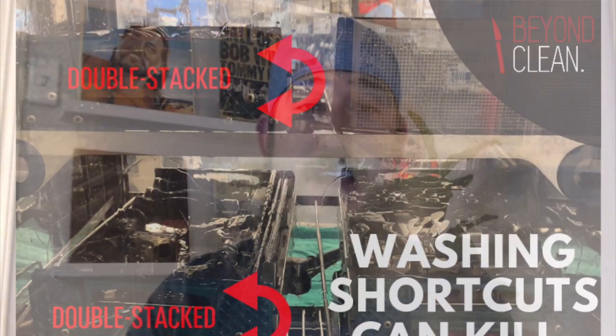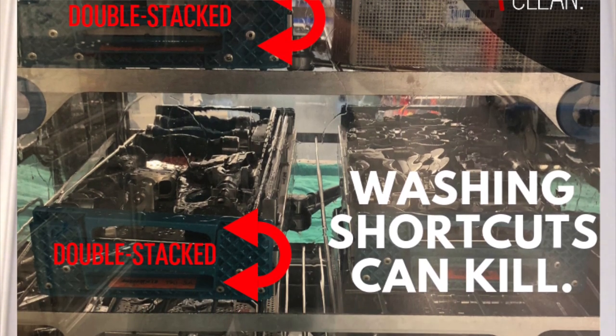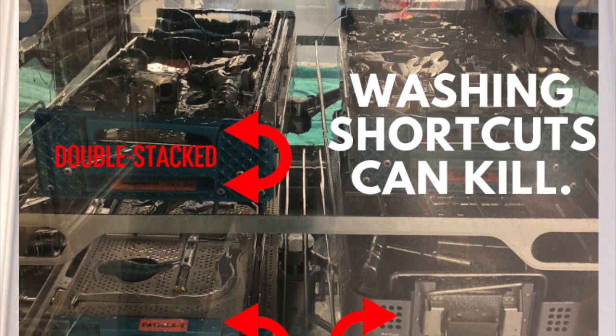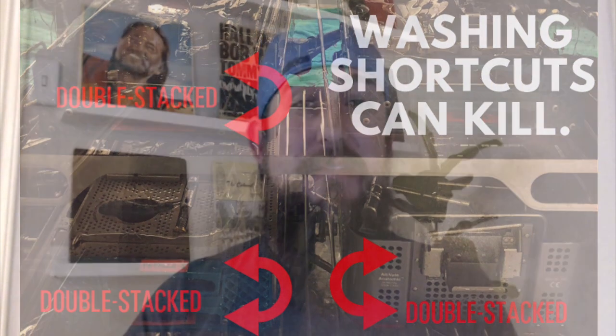They're coming through the wash completely unacceptable and completely counter to the manufacturer IFUs. It is dangerous. That kind of activity can kill your patients. It just takes one microbe, one bug to make it up underneath one of those knee sizers that did not get separated for impingement action in your washer. One bug makes it through the washer — it could kill your patient.